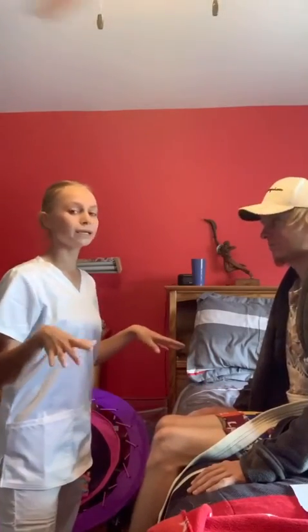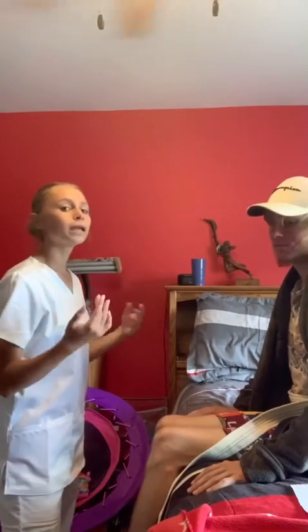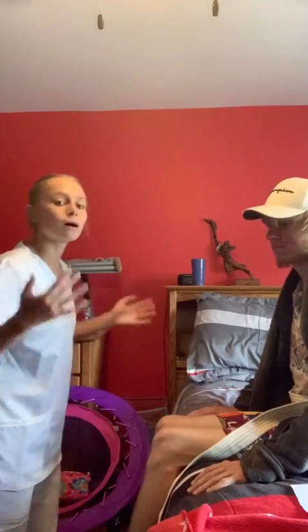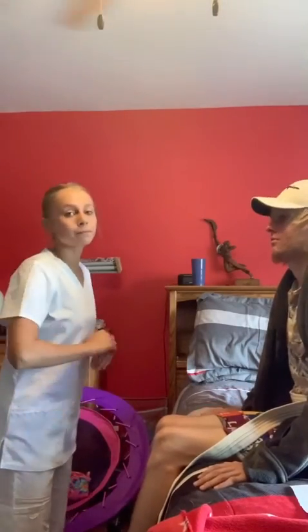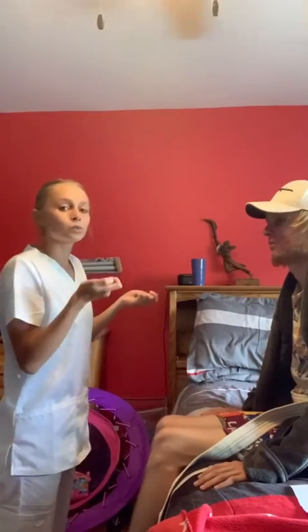So I'm just going to be putting my hands on the side, and so now my patient is going to have his hands flat on the bed, and his feet are also flat on the floor. And I am going to be explaining to him that on the count of 3 is when he is going to push his hands up to help him get up, while I am also bending my knees and then lifting him up as well. And just get up forward a little bit.